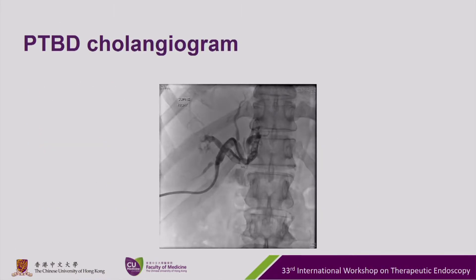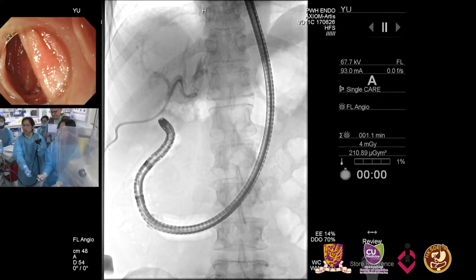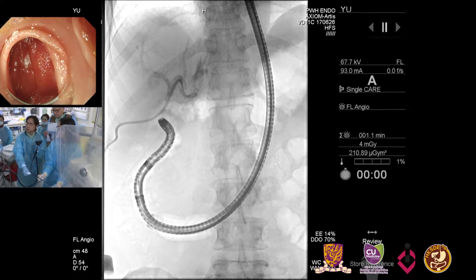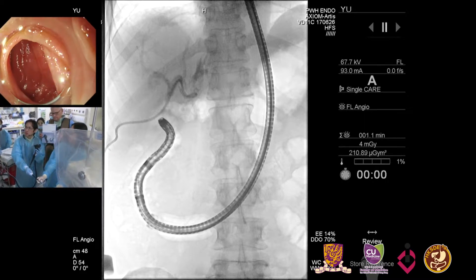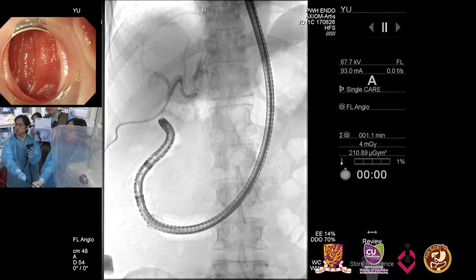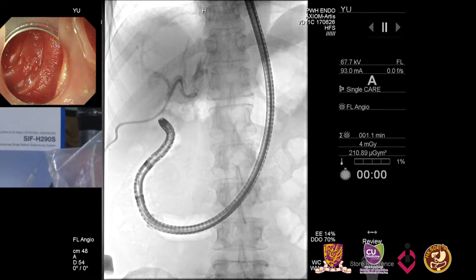The PTBD cholangiogram is shown here. Today we will be doing a balloon enteroscopy-assisted ERCP for this patient. This patient has altered anatomy and I have a new scope from Olympus — a short-type single balloon scope. It's a 290 scope and the length is 1.5 meters.